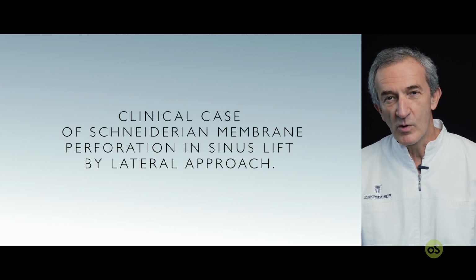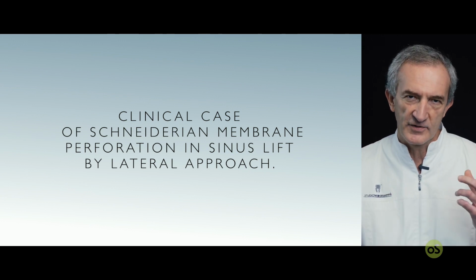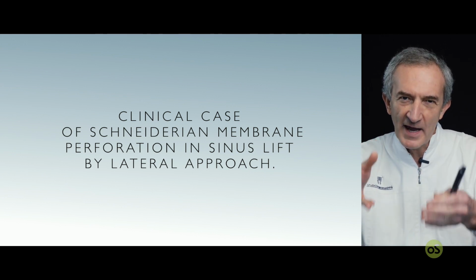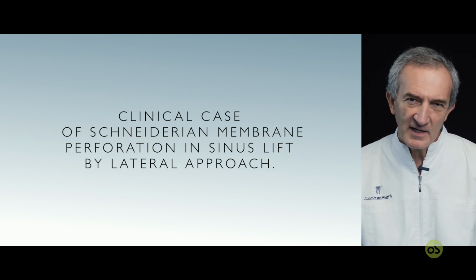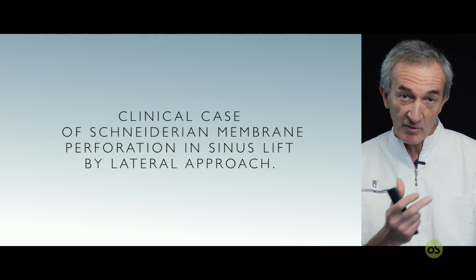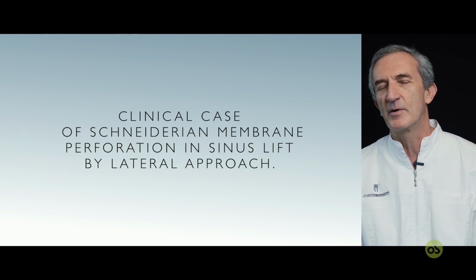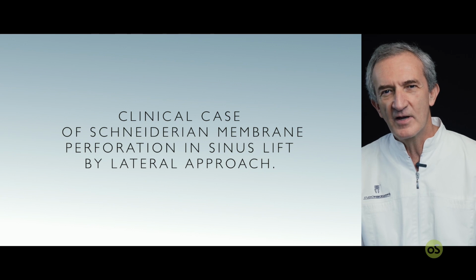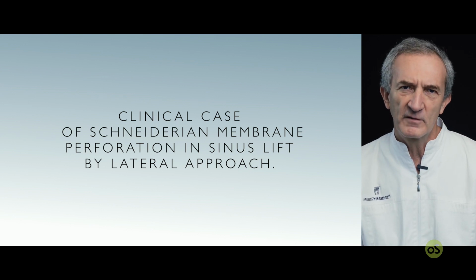But the last and the worst condition is the laceration. The laceration means that the perforation is very large, and it opens completely the visibility of the internal part of the sinus. If we have the laceration at the beginning of the surgery, it's easy to manage because it's sufficient to stop immediately and to follow the same criteria that I told you a few minutes ago about the transcrestal approach. In the case in which the perforation occurs at the end of the sinus lift procedure, during the bone grafting or at the end of the bone grafting, maybe the situation is worse.